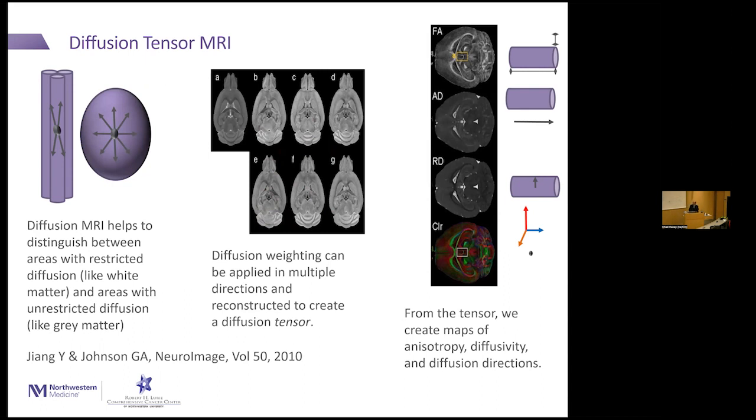You can see this cartoon up here shows the directionality, and this is an example with a fictitious neuron or something like that, and you can see how the direction would be influenced by the confines of the cylinder to reflect in the image.